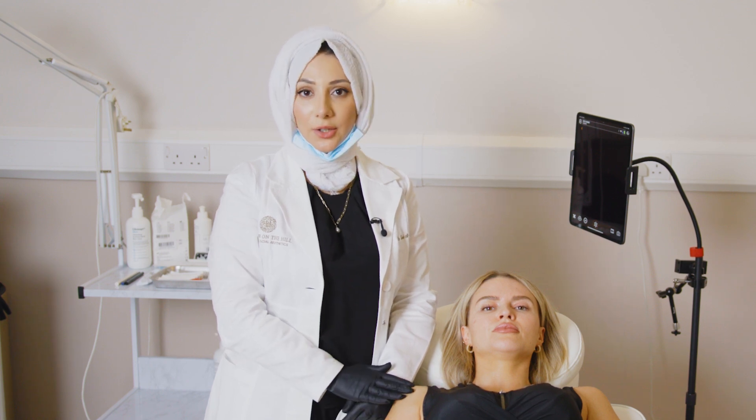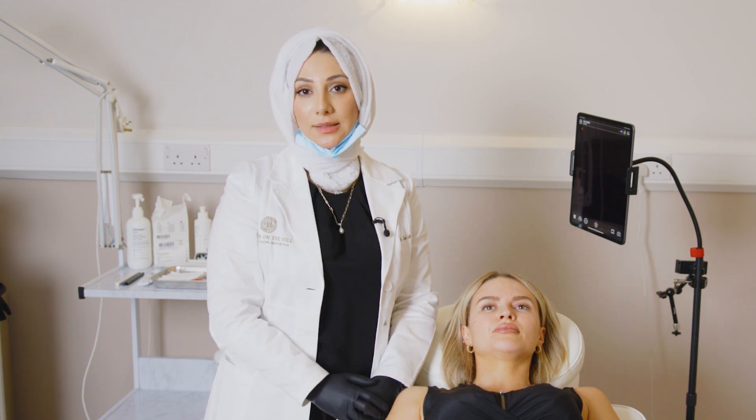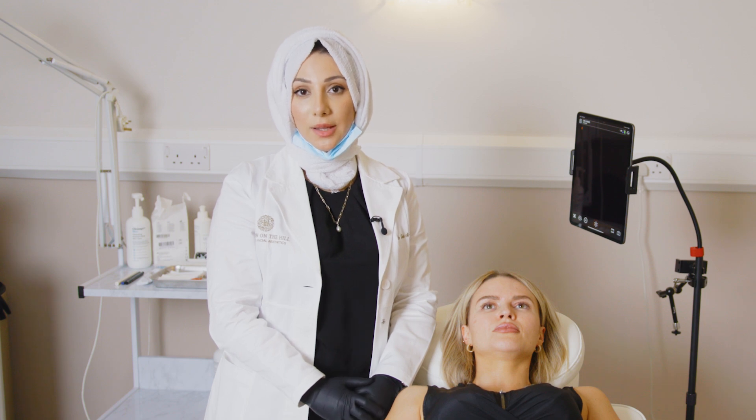Today I have Chelsea here who I will be treating on the radix of the nose, as well as the piriform fossa and nasolabial folds. We will start with mapping of these regions using ultrasound.